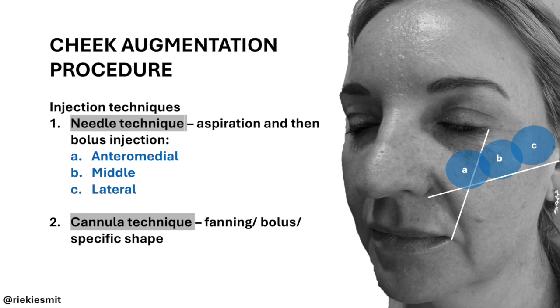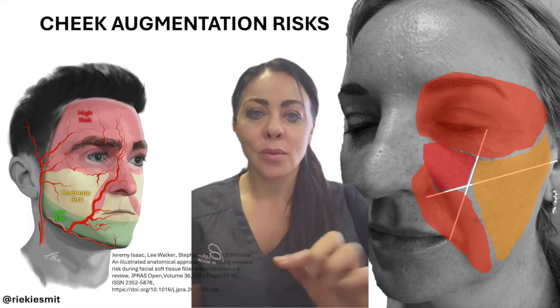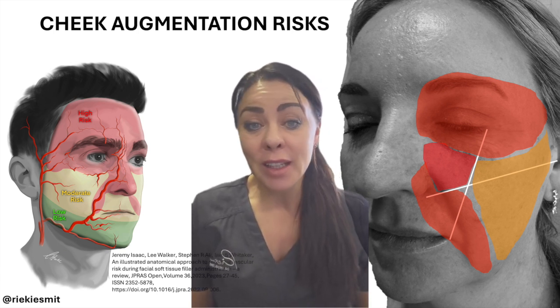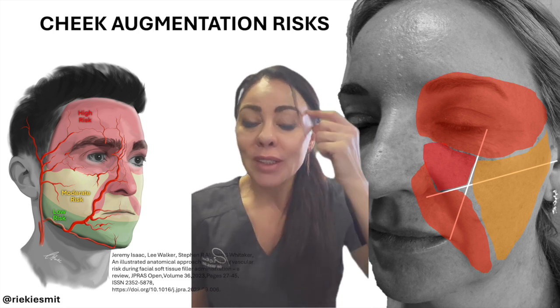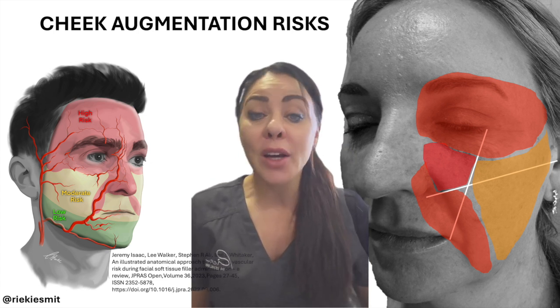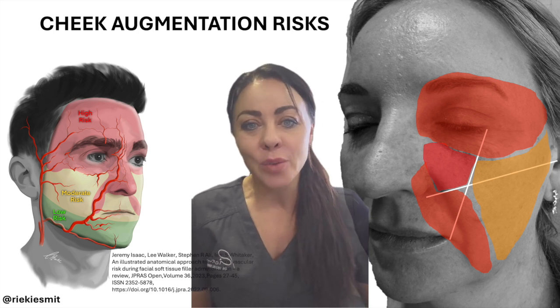We can either go for a needle technique or a cannula technique. Needle is typically boluses and cannula would be more of a fanning technique. Now remember, the facial zone is really not safe at all. We have the very dangerous zones, which are the medial cheek area over the facial artery, over the temples, around the eyes, but it doesn't mean that there's really a safe zone. This is why cannulas are rather suggested for all types of filler augmentation procedures.